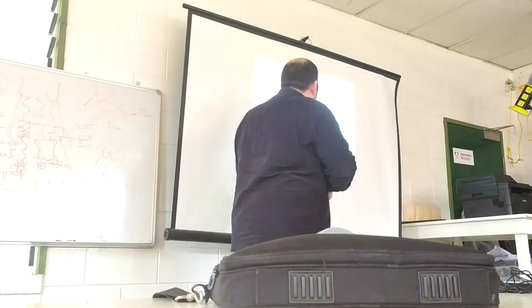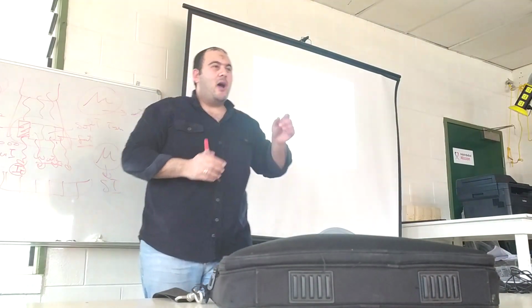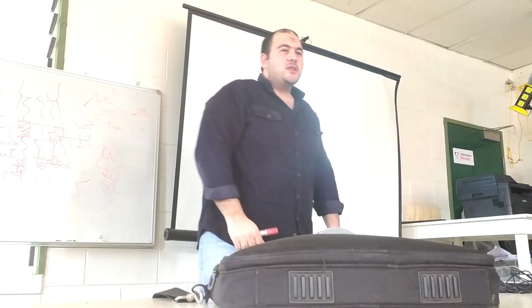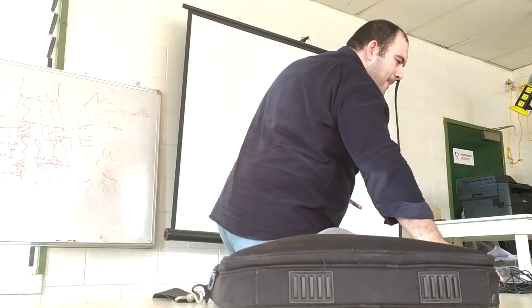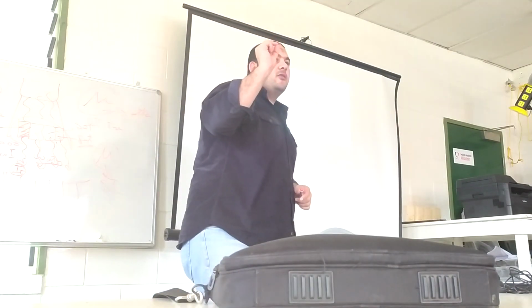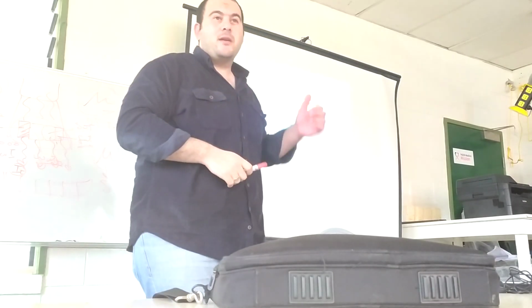This is the second generation. Second generation uses a fan beam of X-ray, not a thin beam. Now we are using a fan beam, or wide beam of X-ray, and increasing the number of detectors to reach 30 detectors. So now we can cover a large area of the patient, not like before. You can scan one slice in reduced time. It's very important.